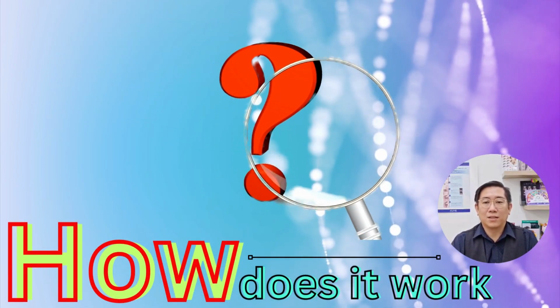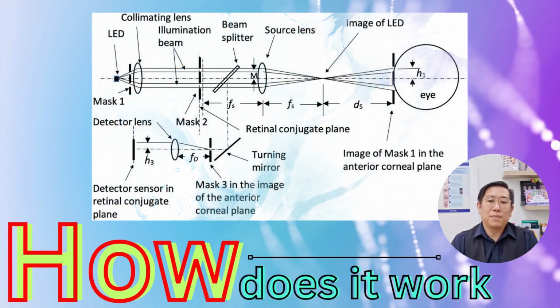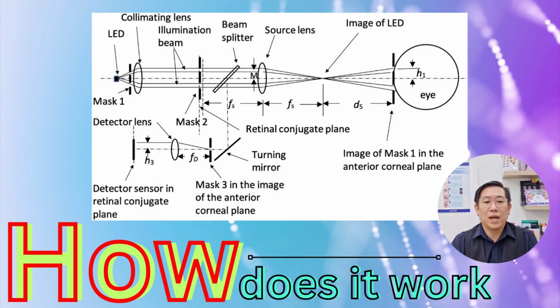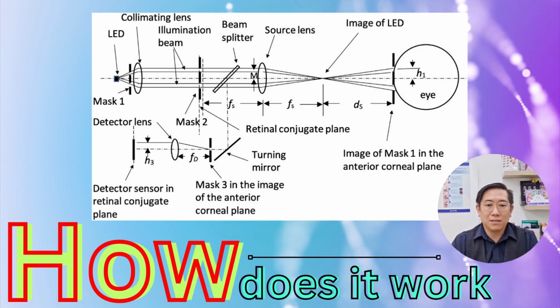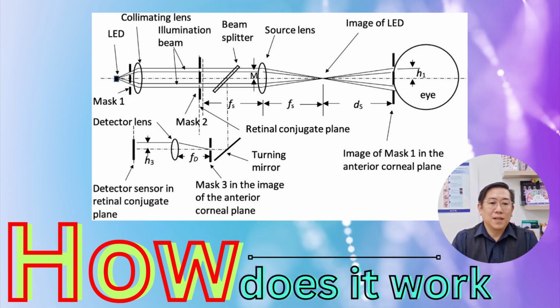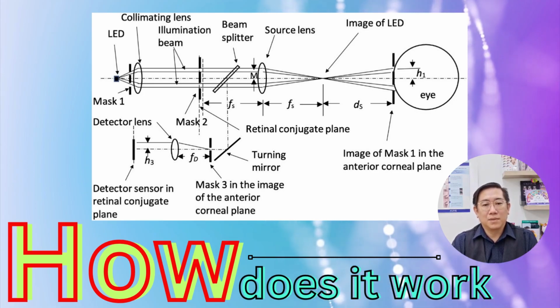Now I'm going to explain how an autorefractometer works using the attached optical diagram to help illustrate the concept. The core principle: digital autorefractometers are light-based diagnostic instruments that evaluate how light behaves as it passes through and reflects back from the eye. The technology combines infrared light, precision lenses, mirrors, and digital sensors to measure refractive errors and corneal curvature automatically. Let's walk through the steps, referring to the diagram on the screen. Let's break it down step by step.